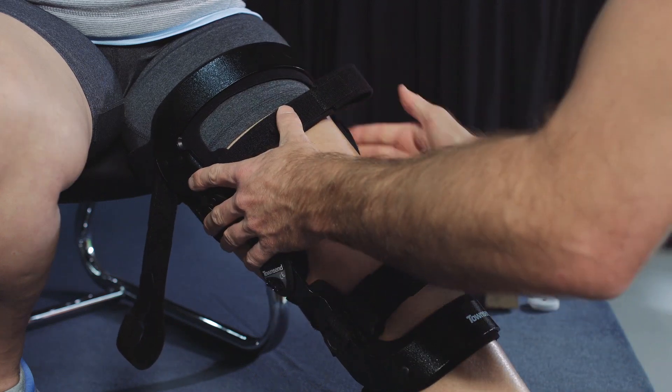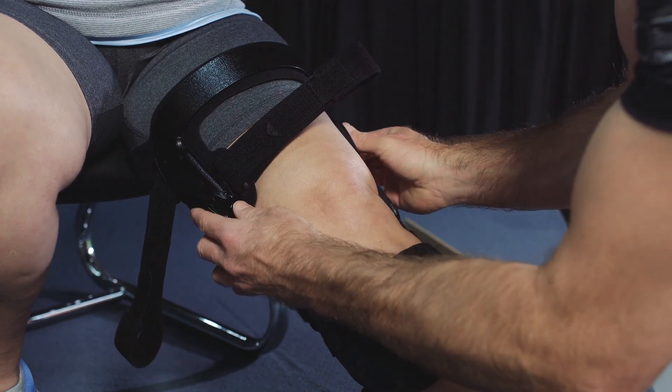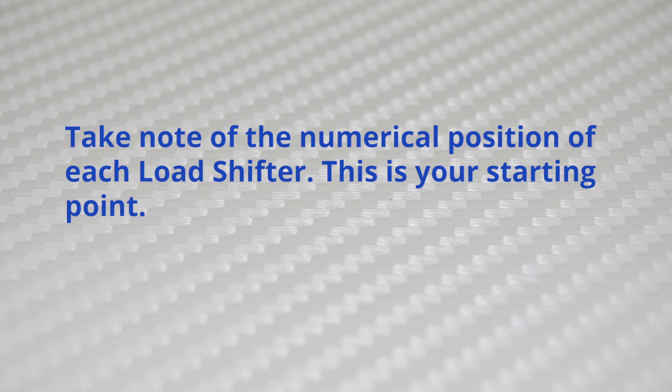By positioning the leg and brace while the patient is non-weight bearing, you can correct the knee to its resting neutral position. Take note of the numerical position of each load shifter — this is your starting point.